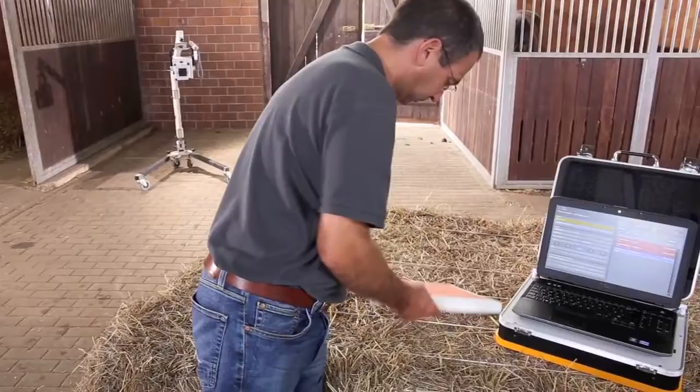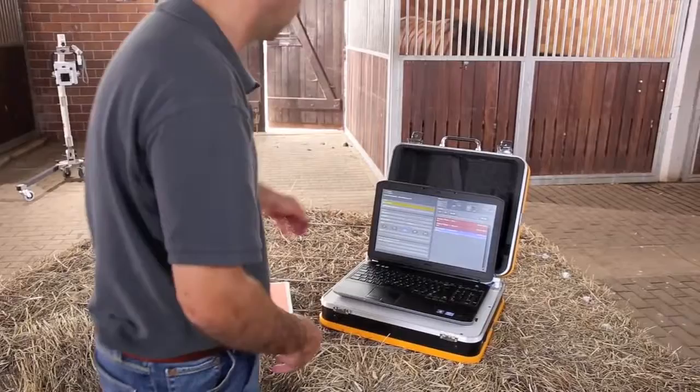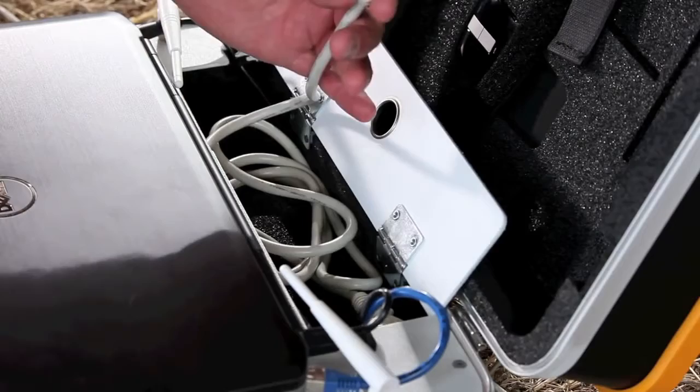Everything is packed perfectly and the detector can be specially protected in a separate shock-proof plastic protection case with a carbon fiber front. The power cable for recharging the battery, when required, is housed in a special compartment.